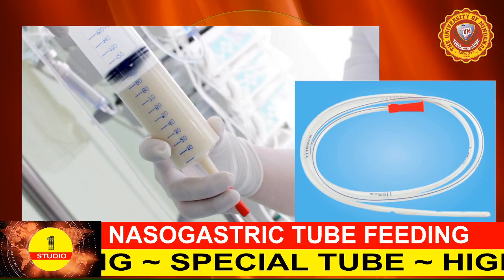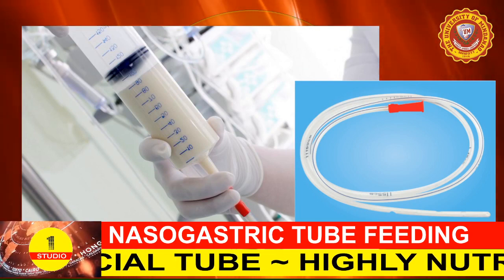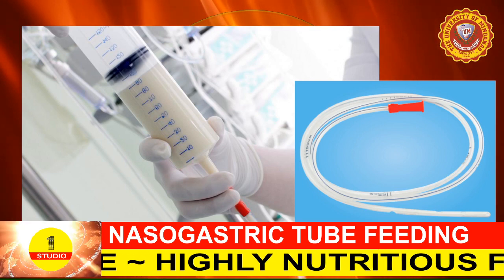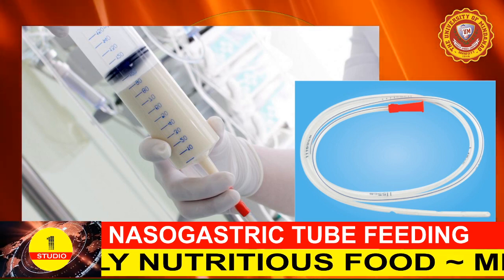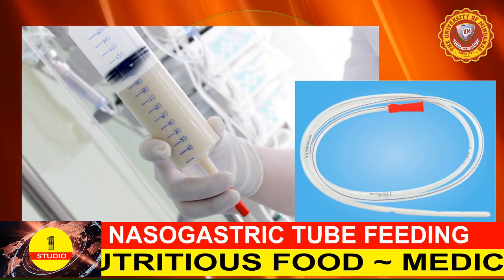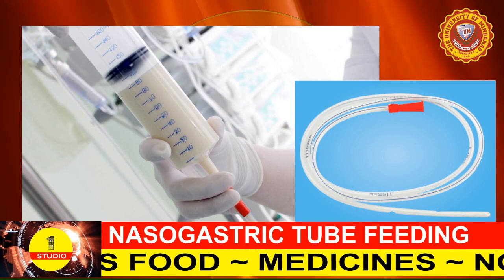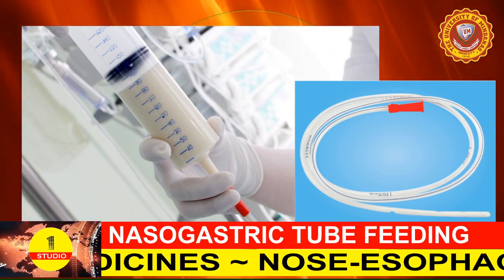Nasogastric tube feeding, or NGT feeding, is a type of enteral feeding method. It administers highly nutritious formula for clients with nutritional deficiencies. Medications can also be administered via a nasogastric tube.